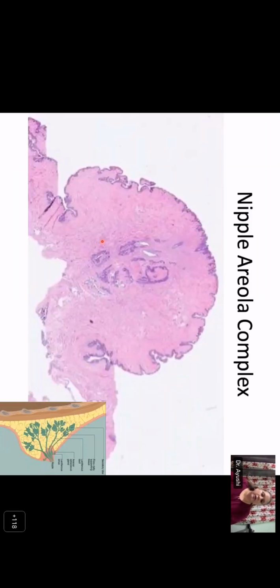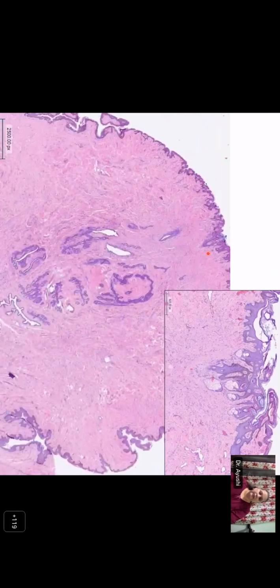The other anatomically important structure in normal histology is the nipple areola complex, and as you know the nipple is the area where all the large ducts drain out onto the skin. When the terminal ducts approach the skin, they can form large dilated sinuses, or in a normal resting state, they can also have a serrated appearance. We don't have pilosebaceous units in the nipple areolar complex in contrast to the rest of the skin, but we do have a large number of sebaceous glands that drain directly onto the skin or into these lactiferous ducts.